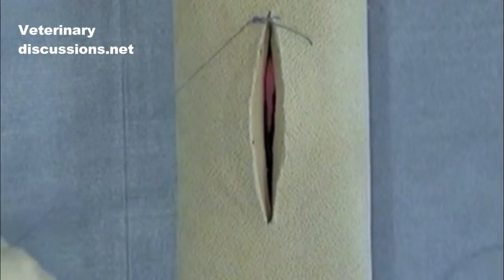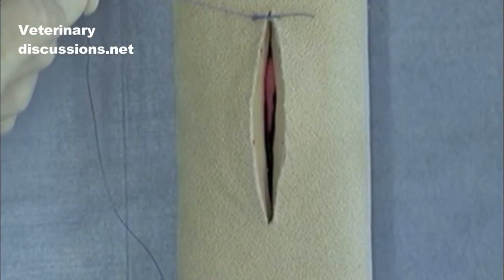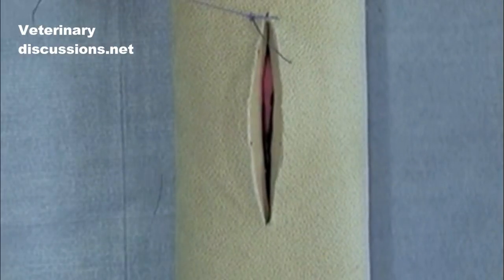You can do this forward interlocking pattern alone, but it's much easier to do with an assistant to maintain tension on the residual suture. I'm going to use an assistant here just for demonstration purposes.